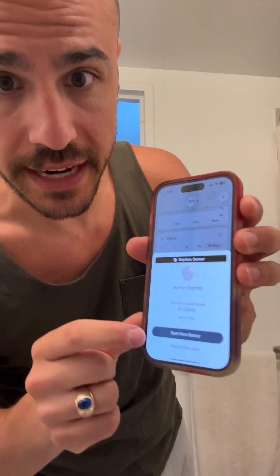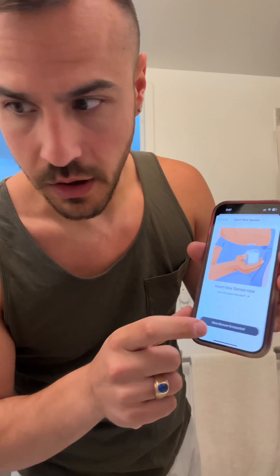The timer is up. Start new sensor. Oh shoot — I need the device. Make sure not to throw it out because you need the code. Going to pair it. Let's see if I have numbers.